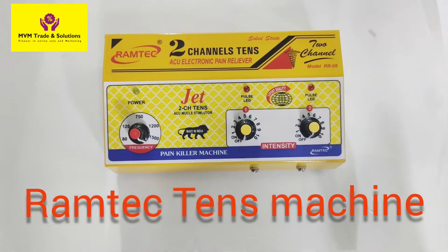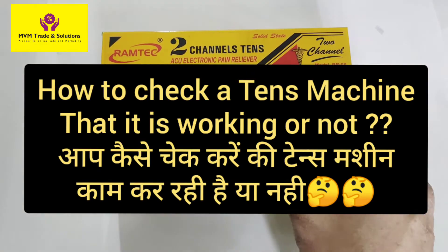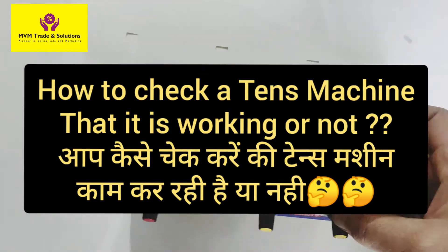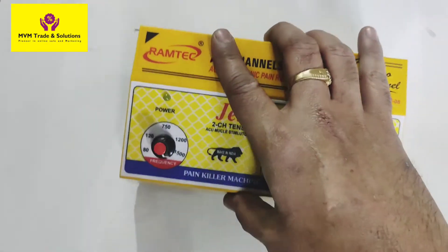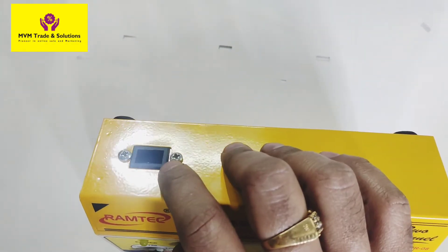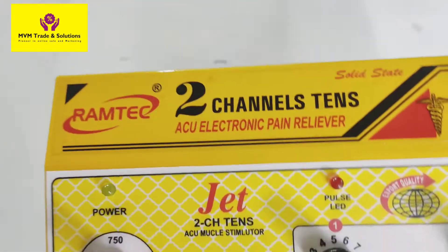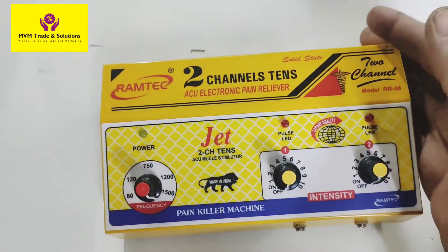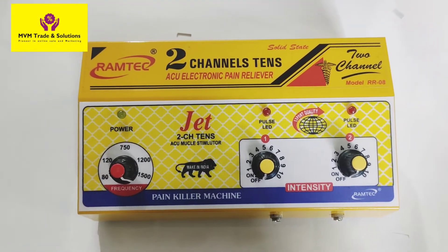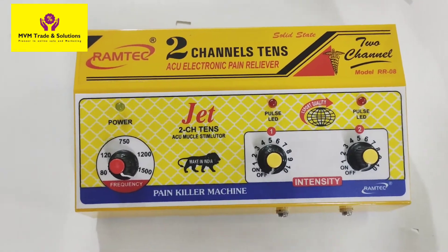Hello friends, today we will tell you how to check if the TENS machine is working or not. Many customers call us after taking a TENS machine and say that there is no stimulation. We will show you how to check if the TENS machine is working or not. There are many reasons for the TENS machine not working.